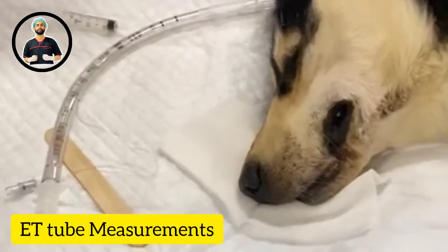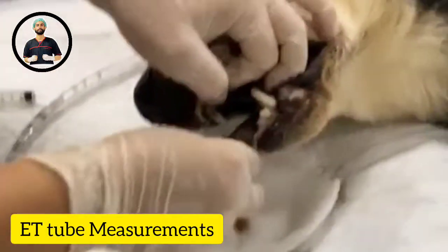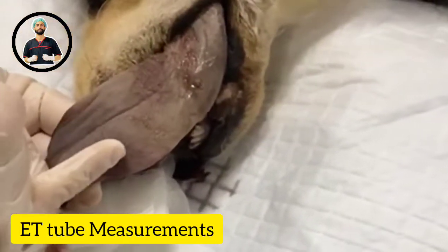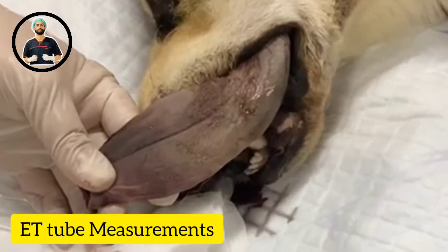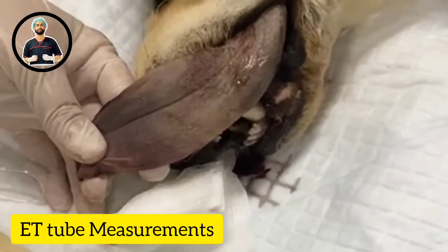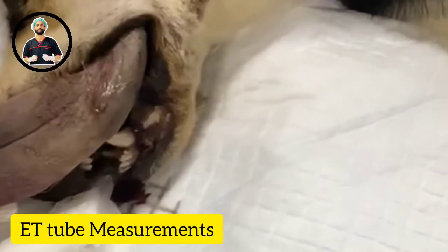This is probably not the correct way you'll find in a textbook, but this is how I do it and I've never had a problem. There are two ways to size an endotracheal tube. If your tube circumference is half the width of the tongue, nine times out of ten you'll have the correct size tube. This doesn't apply to brachycephalic patients — French bulldogs, British bulldogs, occasionally Persians — because their tongues are bigger than their mouths and their anatomy is really different.